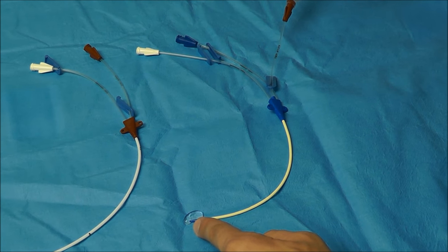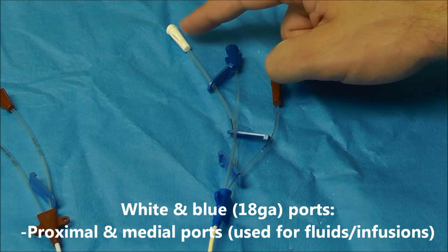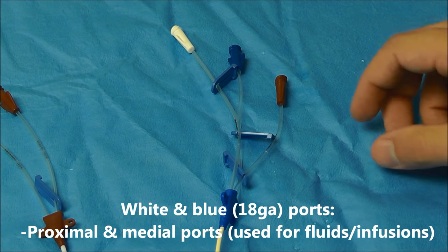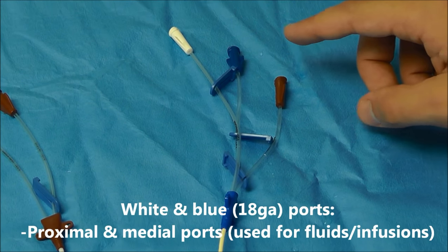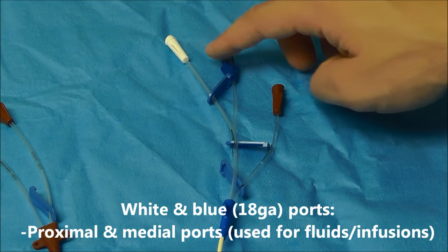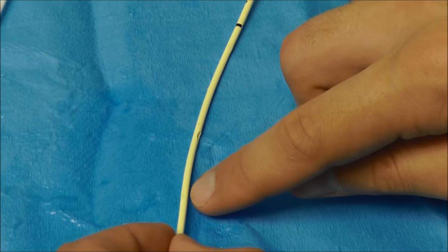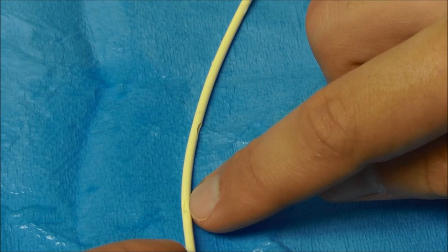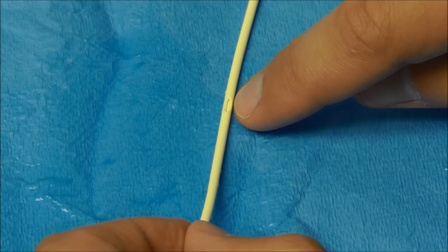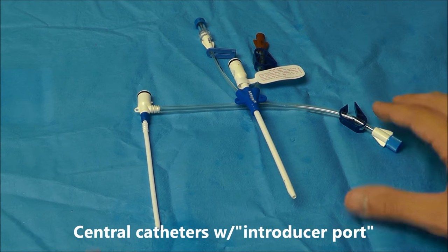The blue and white ports on this triple lumen are referred to as the medial and proximal ports because injecting through these ports, if you come down, that fluid is going to come out through either that port right there or that port right there.